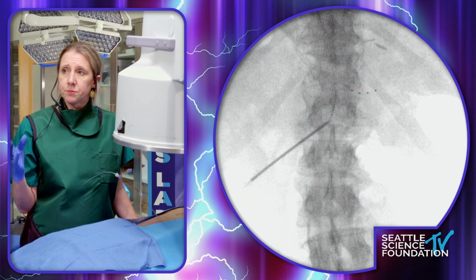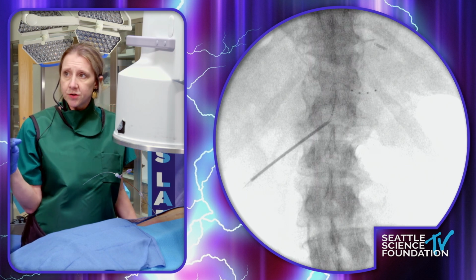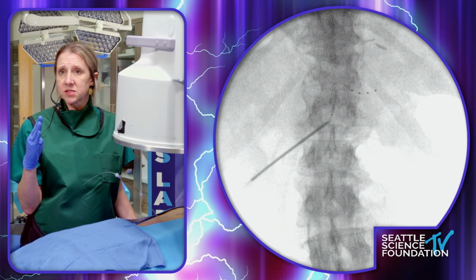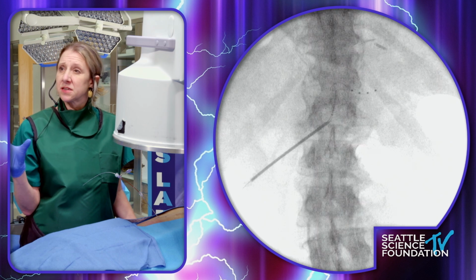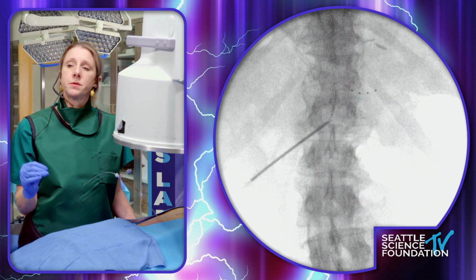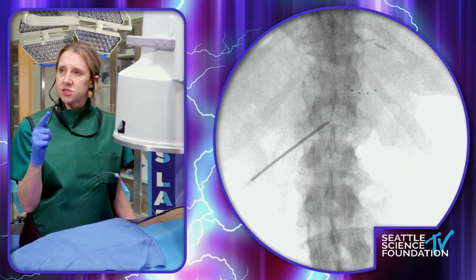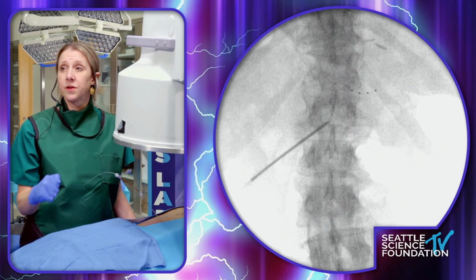Functionally, what we're trying to deliver is a lead that extends out the neural foramen with the most proximal two contacts being beneath the pedicle. This allows a lot of territory for your programming representative to stimulate that dorsal root. And then you want to create, ideally, a strain release loop that extends slightly cephalad, as well as one that is either at the level of the neural foramen or inferior.